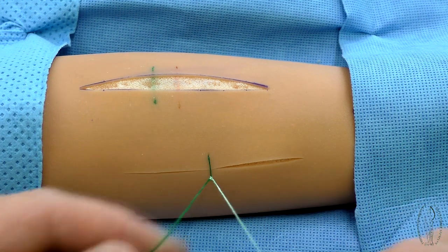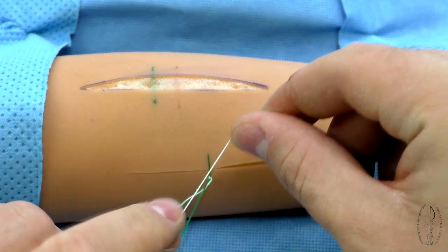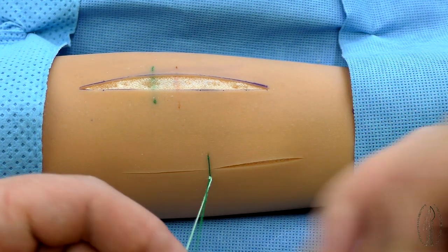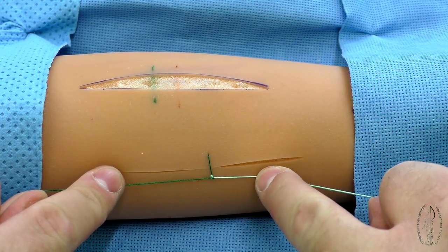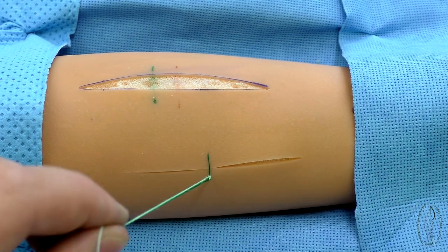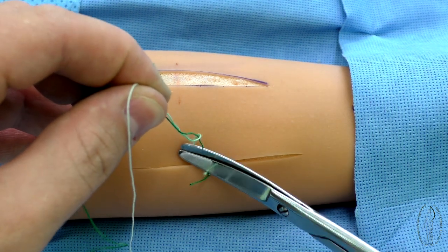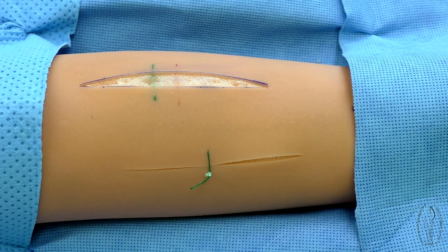The filaments are tensely held in order that the primary loop has not dispersed at the formation of the second loop. Then the third loop is similarly formed. The ends of filaments, which are cut off, are tensely fixed. Scissors are brought flatwise, turned on an edge, and the filaments are crossed by the blade ends of scissors.